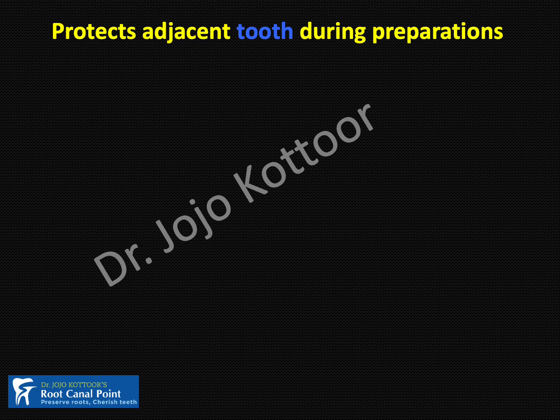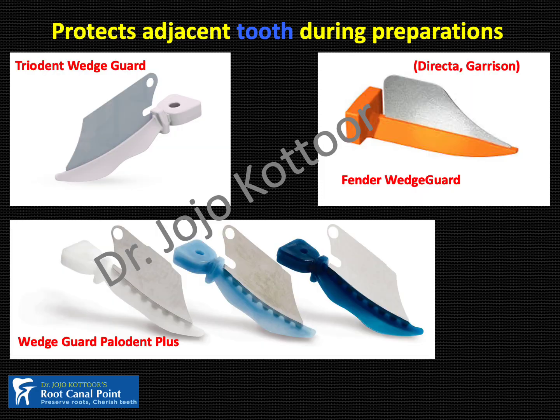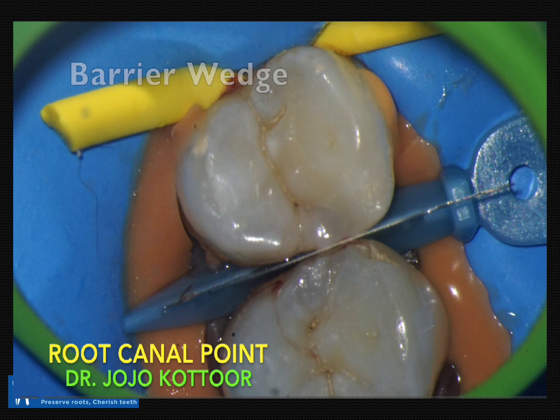The third application of the wedge is to protect the adjacent tooth from injury while doing class 2 cavity preparation. This is primarily achieved by Fender wedges or wedge guards. Fender wedges are produced by Garrison, and wedge guards are produced by Trident or Paladin. Here is a clinical example: I am doing a cavity towards the distal aspect of the first premolar and don't want to injure the mesial side of the second premolar, so a Fender wedge is placed between them before initiating cavity preparation.